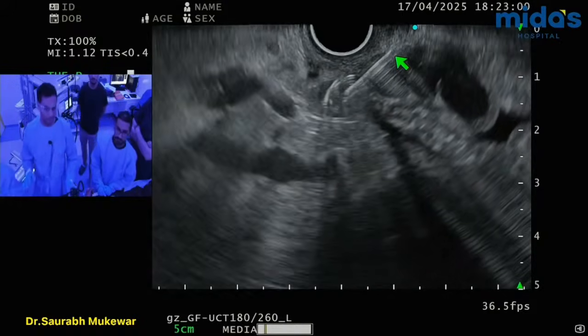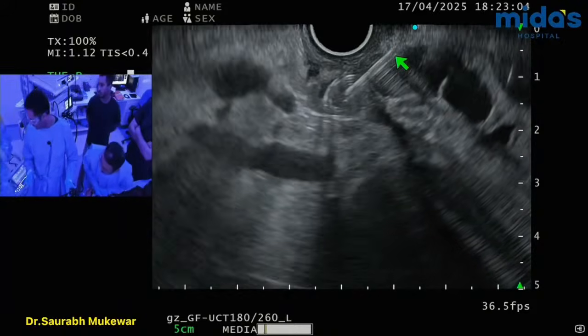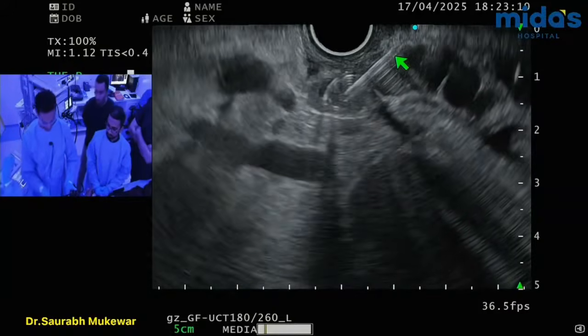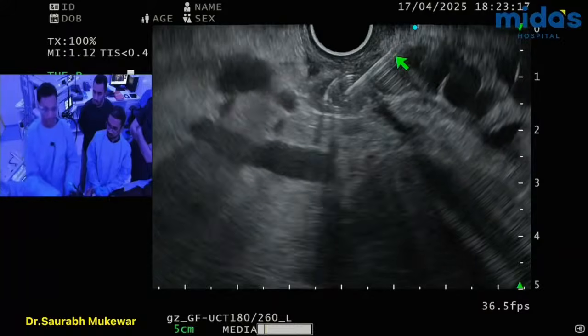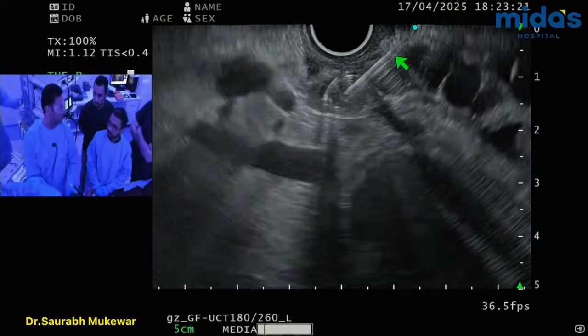Maybe I'll put another coil there, so it's nicely packed. And just keep him stable. Ready? To see how the coil loading is, right? So the coils we use are Cook, Nestor coils, right? Yeah. You've seen this before? These guys?